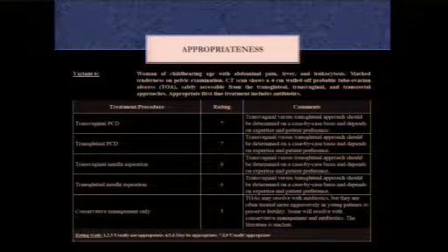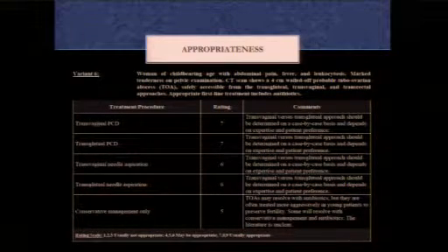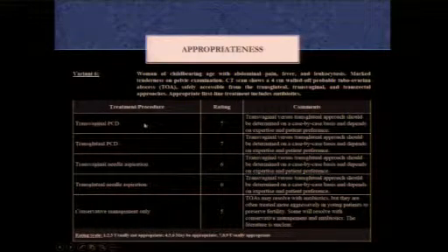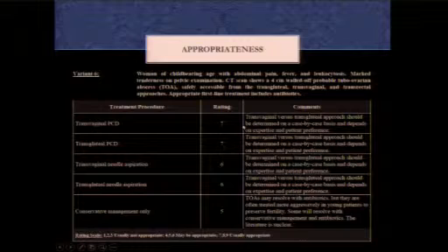And the last clinical scenario here is a patient with a pelvic abscess, in this case a tubo-ovarian abscess. And there's a number of different modalities you can use here. So percutaneous drainage is usually indicated if you have a tubo-ovarian abscess that's not resolving. And you can use the transvaginal approach. Transvaginal tends to be preferred in certain cases, and I'll go into that more in a bit. Transgluteal is another approach that you can use.